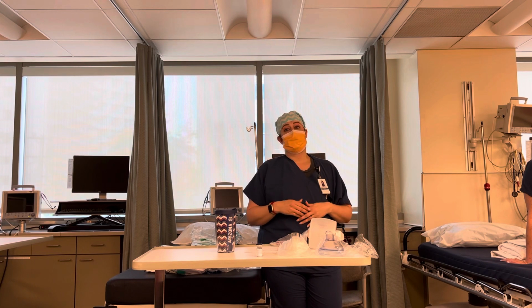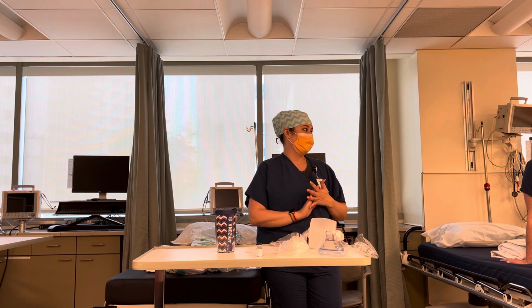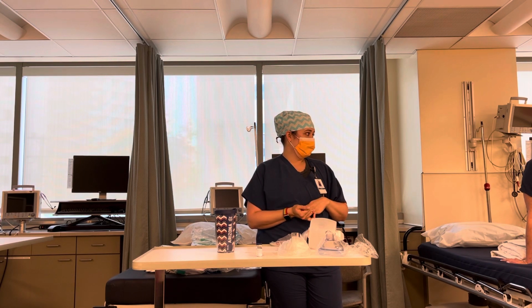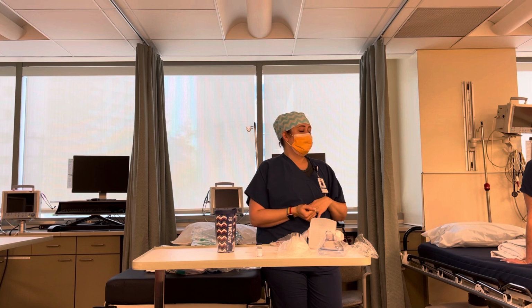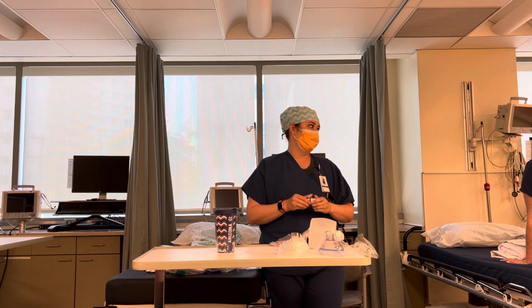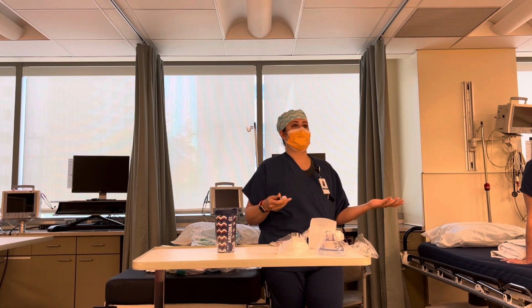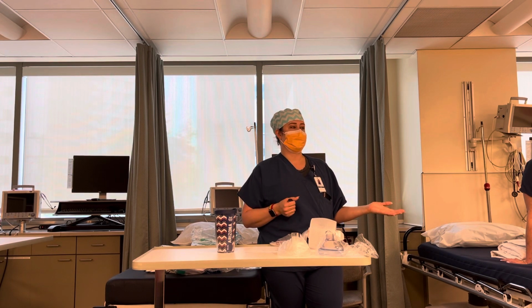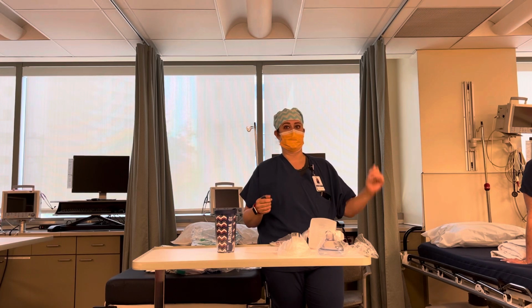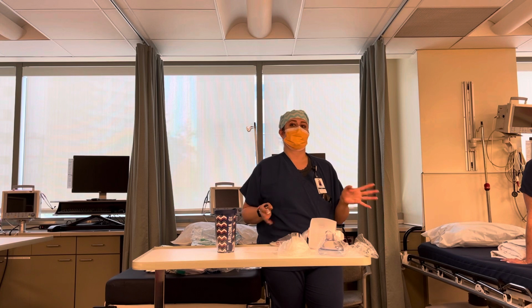So, really important to know the airway equipment we'll ask for, know Rocuronium, where it's at, and those door codes. Anything special, like if your hands are occupied, anything special about drawing it up? Do you want the whole thing? It's a 5 cc syringe, and then we'll tell you how much we would want you to give, as a nurse. Or honestly, if I had no other hands, I would ask the GI doc or the MA to push under my direction in an emergency if I had to.